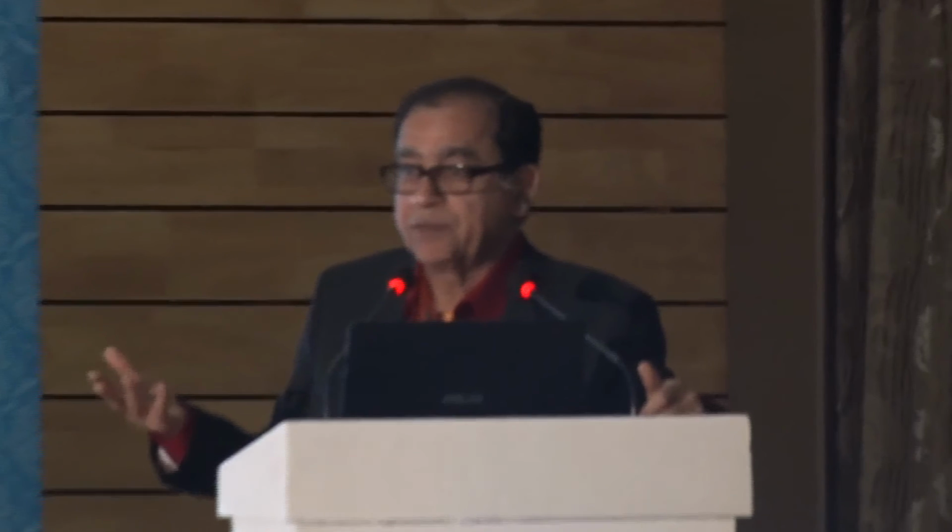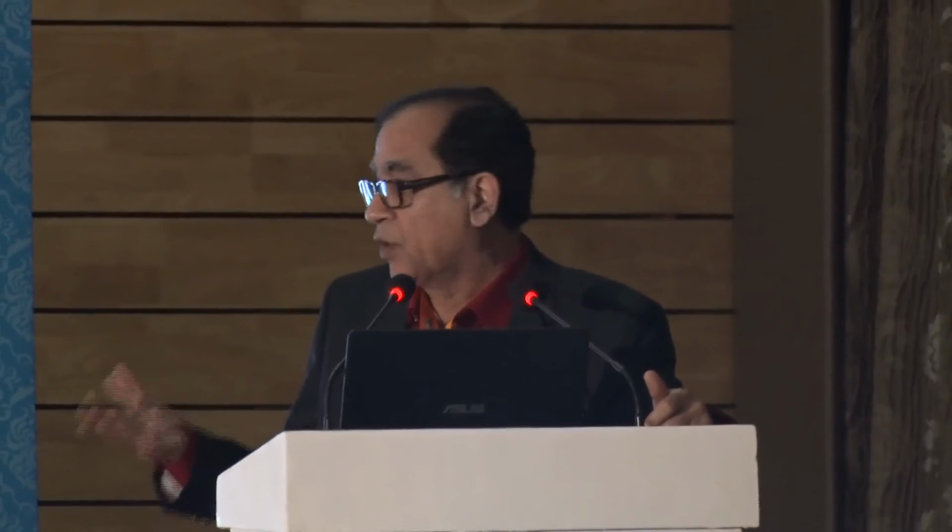Yes. It was high myopia, the orbit was very tight, the globe was large, the patient was little, and actually I was feeling guilty. There was no need to actually give a block in this patient. But I thought, as I'm telling you, this would be a very good case for recording. So I asked them to give the block so that the patient is quiet and I can do my recording very nicely. That was the reason. But it has been managed very well.